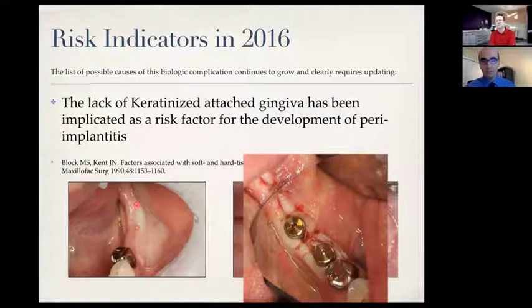As opposed to if we don't do this procedure, then we end up having implants encircled by mucosa. It's interesting because in some situations you can actually pull the cheek away and see the mucosa separating itself from the titanium. So you can imagine how bad that pouch could be, and how bacteria can go in and hide and eventually cause your implant to fail.